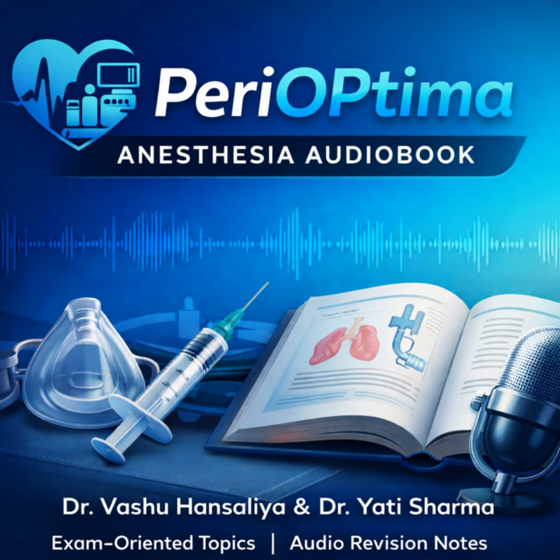All right, let's establish a foundation then. When we talk about fiberoptic intubation, how are we defining it? And what exactly is the tool we're using? Okay, so fiberoptic intubation, or FOI, we define it as the planned, controlled insertion of an endotracheal tube, an ETT, over a flexible guiding scope. Right, so you can see the larynx and trachea indirectly. Exactly, in real time. The primary tool, and you have to be ready to discuss this in depth, is the flexible intubation scope, or FIS. Sometimes called the fiberoptic bronchoscope, or FOB. They're used interchangeably, yes. And crucially, you should state that the FIS is the most widely used, most versatile, and frankly most trusted indirect laryngoscopy device we have.